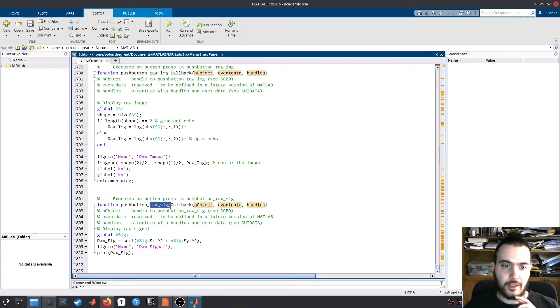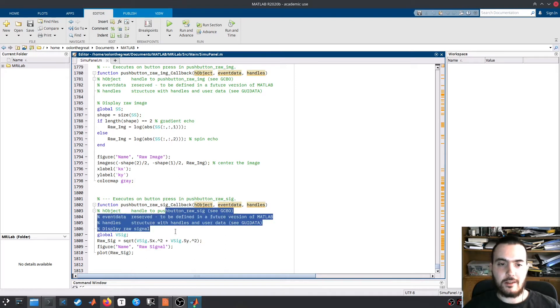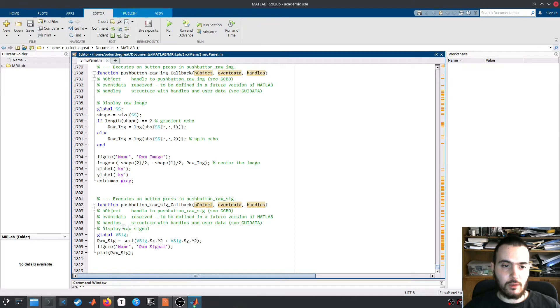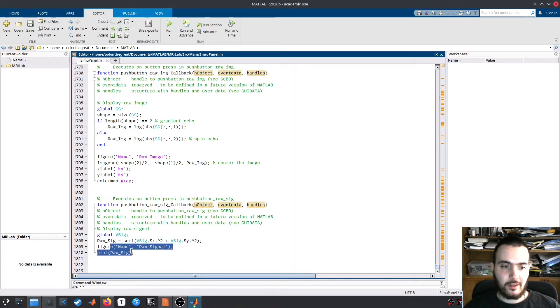In the raw signal callback, which is executed whenever the raw signal button is pressed, this is simpler. We take the global variable where the code stores the signal, and I take the magnitude and show the plot.